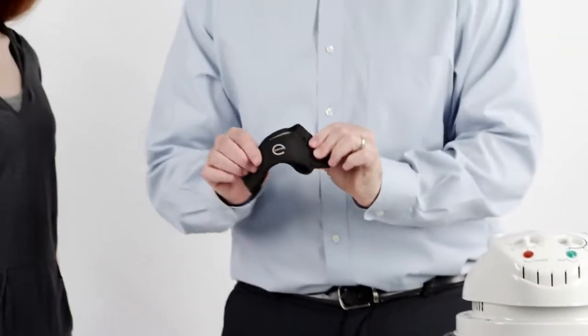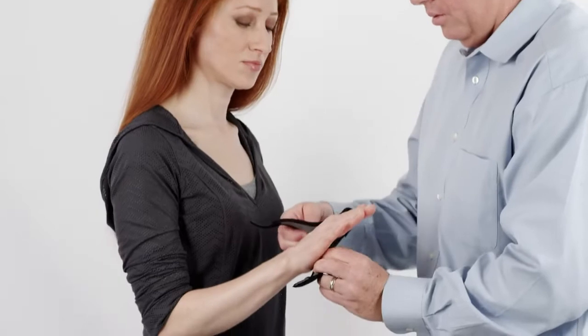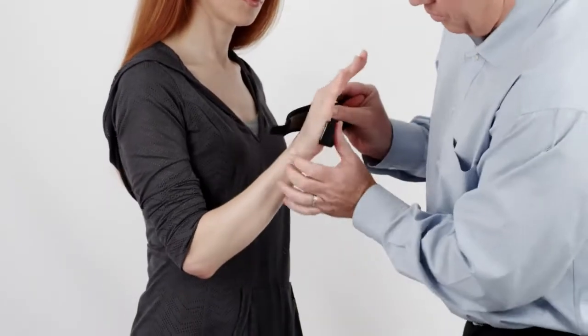Refer to the instructions provided with that oven for heating instructions. Gently apply to thumb and hand.